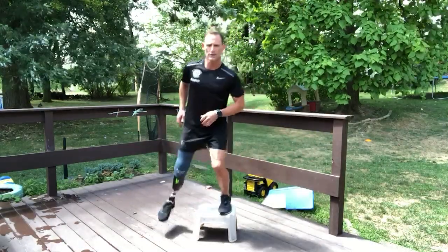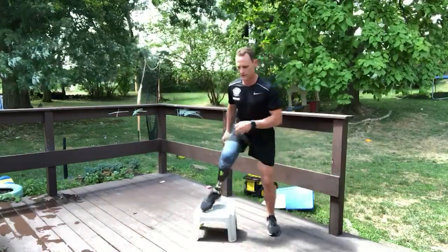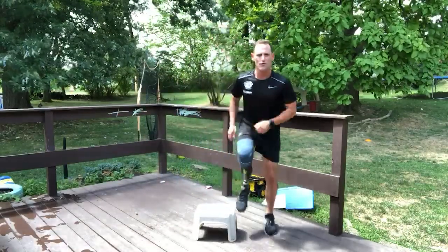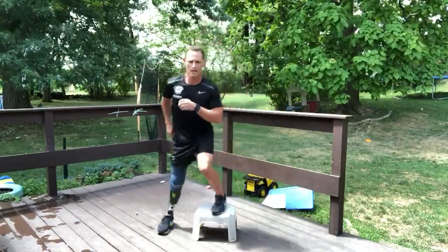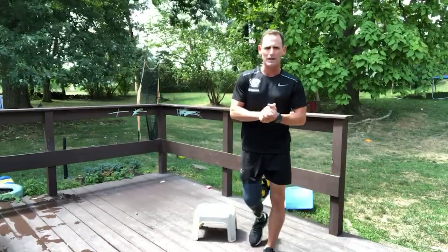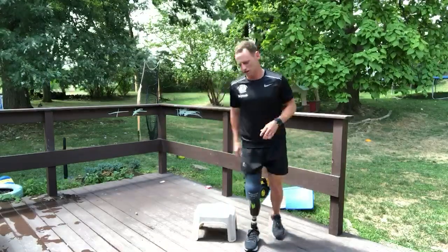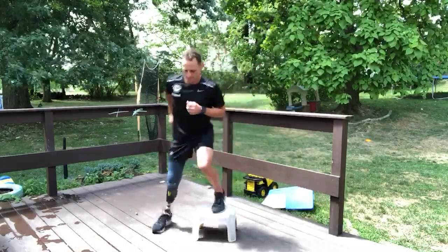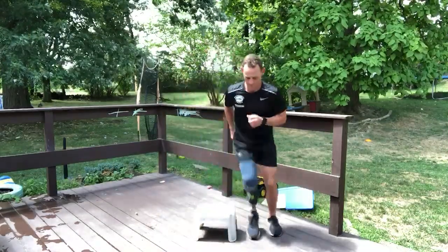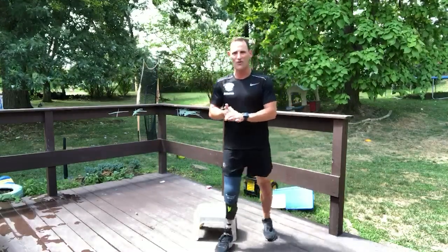Step up, step down, step up, step down. Establish the rhythm. Step up, step down. All right, once we're comfortable with that, we can begin to speed it up a little bit. Just make sure you're comfortable with that, but it's gonna look a little bit more like this. All right, there's the second one.